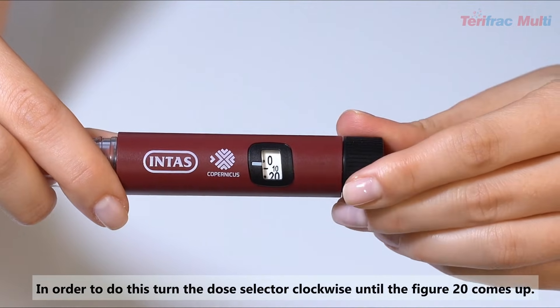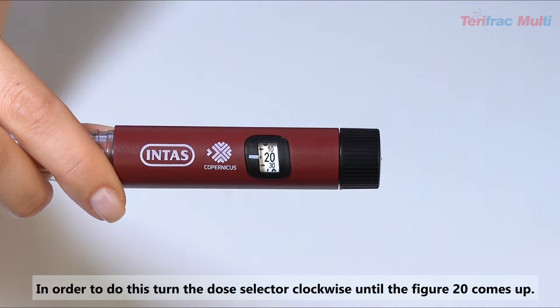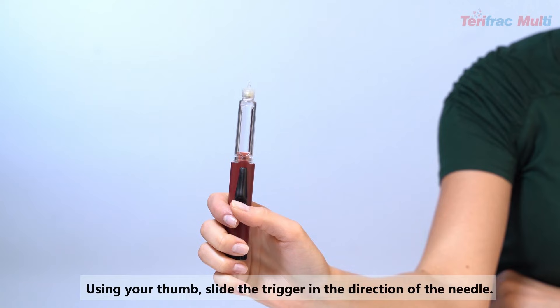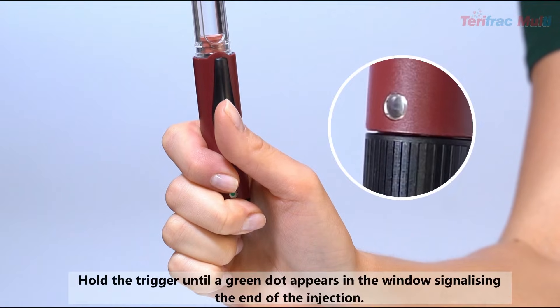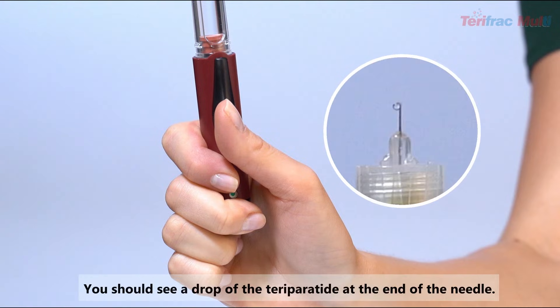In order to do this, turn the dose selector clockwise until the figure 20 comes up. Now hold the pen with the needle facing upward. Using your thumb, slide the trigger in the direction of the needle. Hold the trigger until a green dot appears in the window.